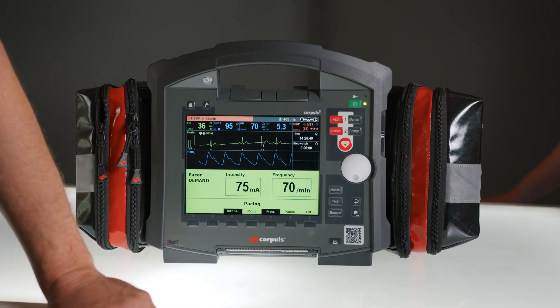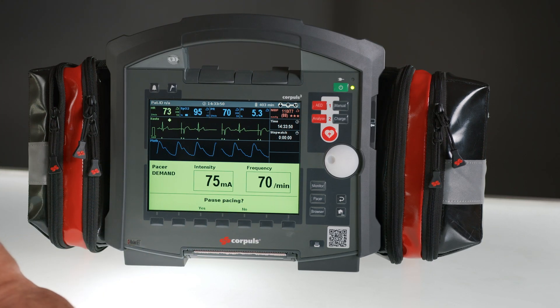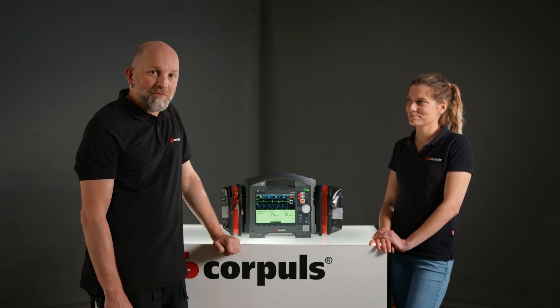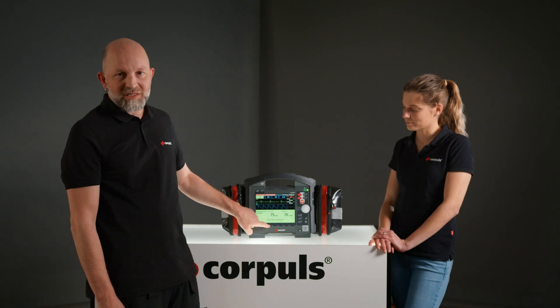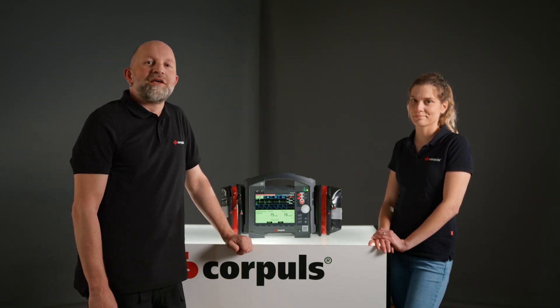To interrupt the PACER therapy, you can press the pause soft key here. A safety prompt will appear — yes, I want to pause. Now the therapy is paused. To resume it, simply press resume again. The safety prompt appears, and yes — the therapy will continue with the preset values.